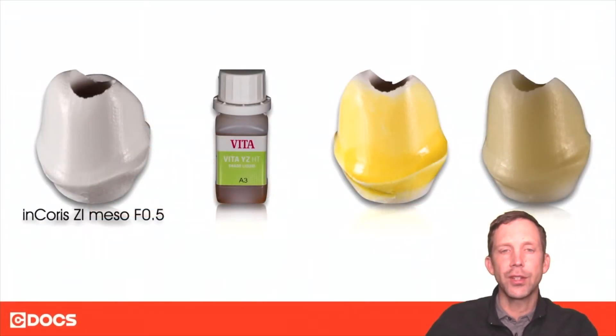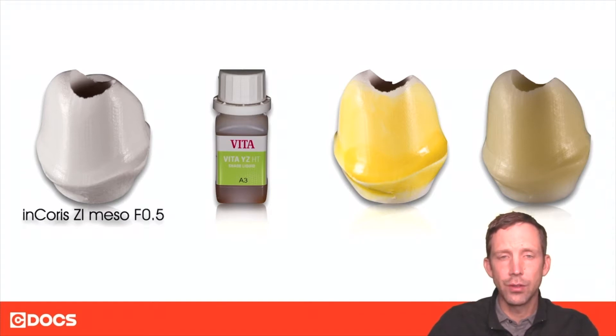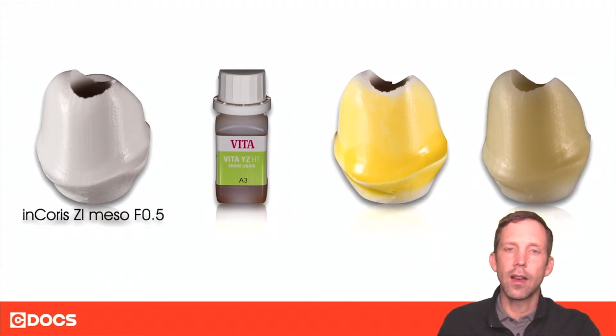Zirconia infiltration is painting a liquid onto pre-sintered zirconia to change its color after sintering. On the left hand side you can see a custom zirconia abutment — it's fairly white, and there are not a lot of shading options when it comes to zirconia abutments. So if you wanted to change this white zirconia abutment to an A3, you can use a number of different zirconia infiltration liquids.